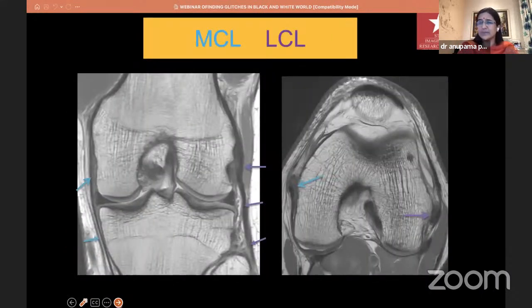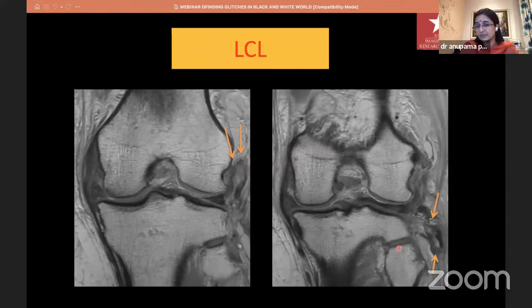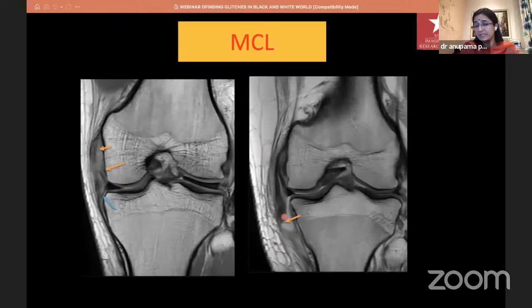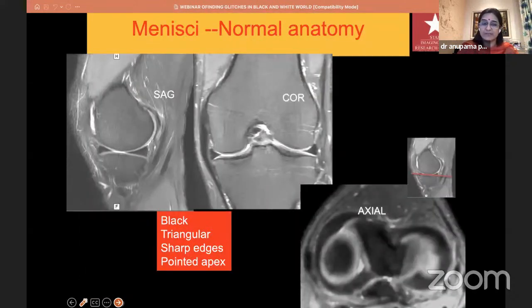For MCL, a high-grade injury from the femoral attachment and a complete avulsion from the tibial attachment — the important thing to remember is that the MCL attaches very low down, so sometimes it doesn't get included in the field of view. You have to look for it very carefully. Menisci are also black. Normal menisci — whether on sagittal or coronal — are triangular in shape with sharp edges and a pointed apex. Any change in signal, change in shape, blunting of margins or edges is abnormal.